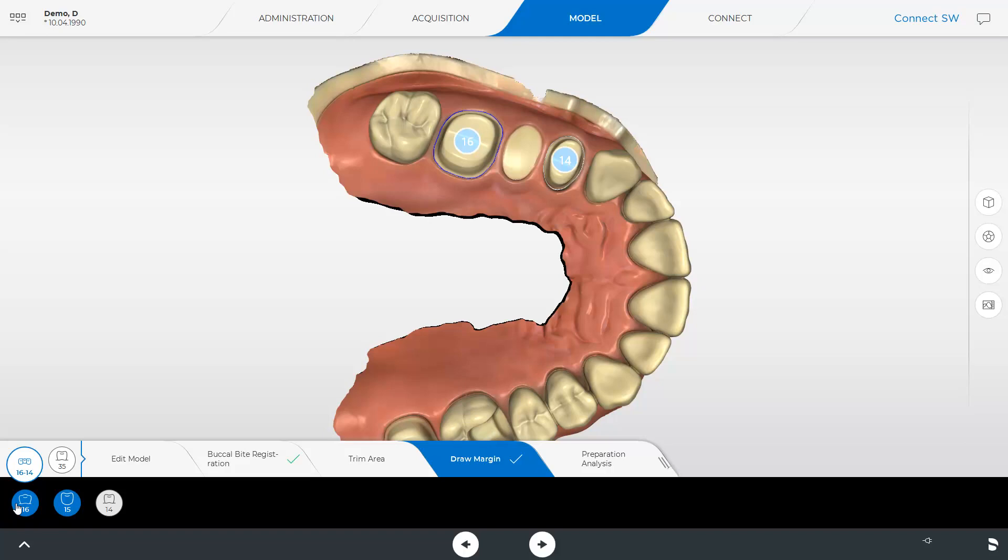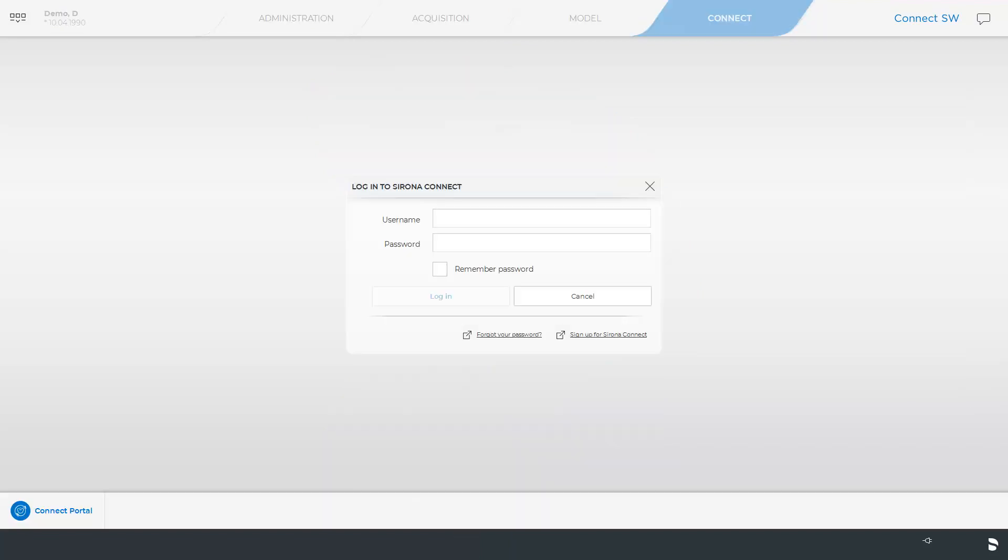At this point, we will finish the model phase and continue with the last phase, Connect. To be able to send case data through the ConnectCase Center portal, you and the receiving partner need an internet connection and a ConnectCase Center customer account. Detailed information on how to register can be found in our video tutorial on the topic of Customer Registration in the ConnectCase Center portal.